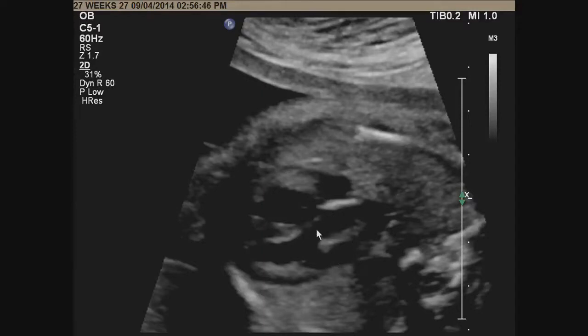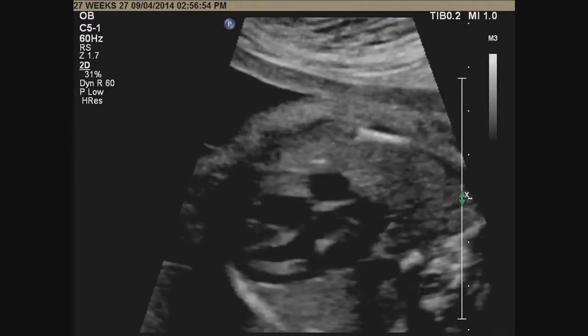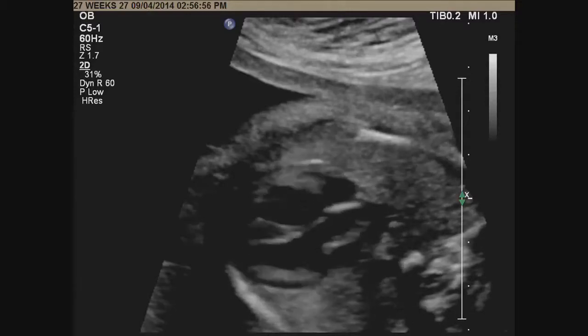In mild aortic stenosis, one of the features is you still see some valve leaflets that can't open all the way into the heart. And that should be your clue to look at. The third thing you need to look for is when you look at the ascending aorta, look at the size of the aorta. It should be uniform throughout as it comes out. Many times with aortic stenosis, you have post-stenotic dilation of the vessel, so you have ballooning of the vessel after the valve annulus. And you look here, it's nice and clear.